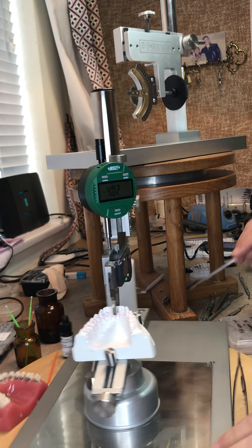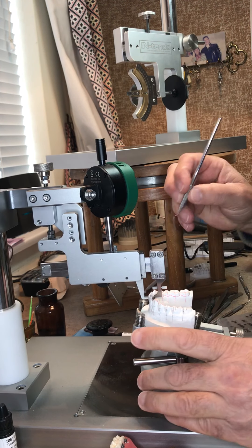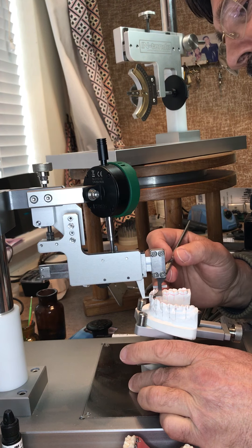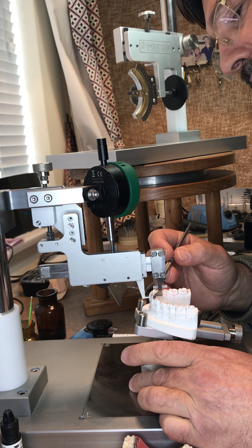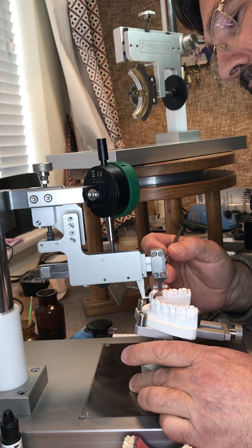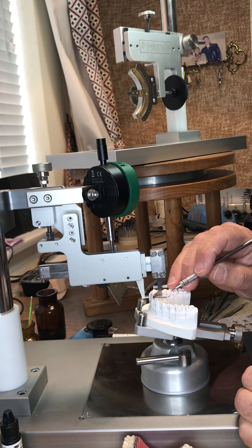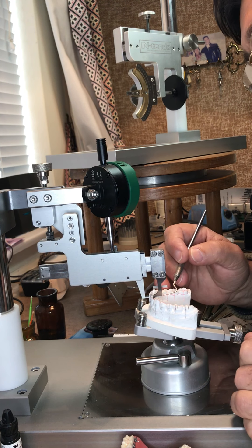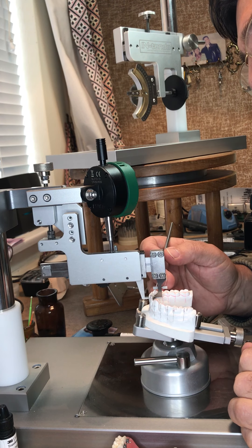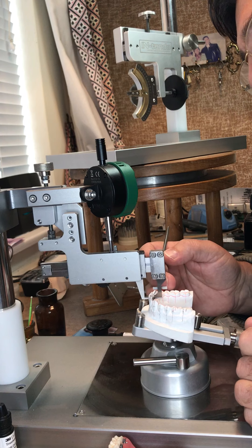I get another instrument to clean and make sure the bracket is central on the tooth. I clean underneath the bracket and make sure there's no excess composite — especially not near the mechanism if it's self-ligating.